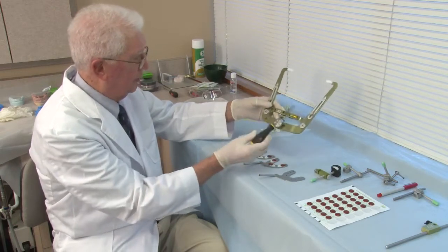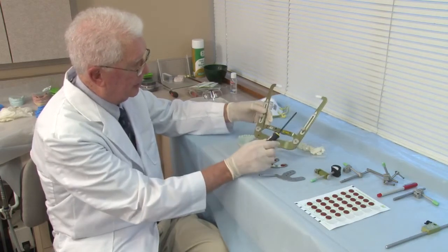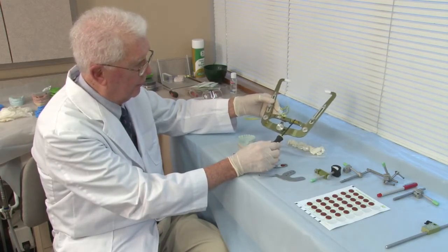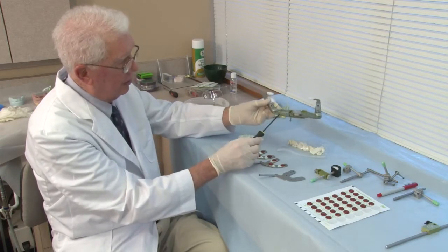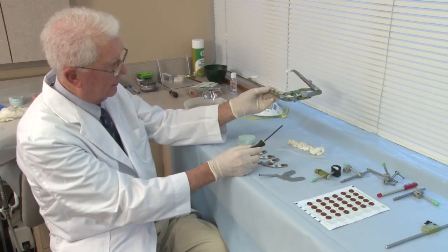You want to put some finger cots, which I have here, on the part that goes in the patient's ears. And our first thing we're going to do is take a natural head posture ear bow. And we're going to use this bubble here, this level, to determine when I have the face bow at an exact level position on the patient.